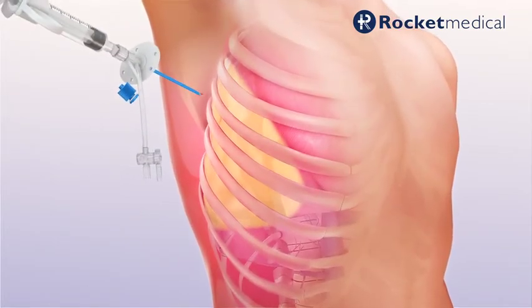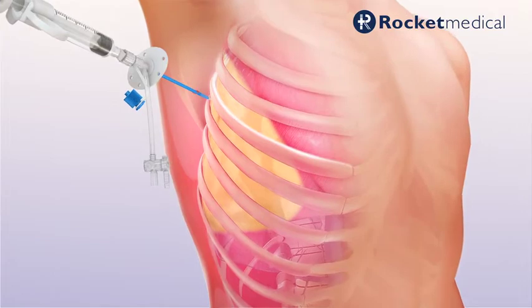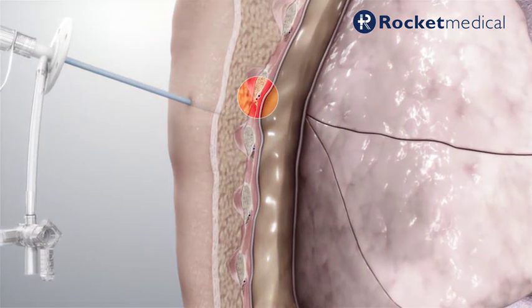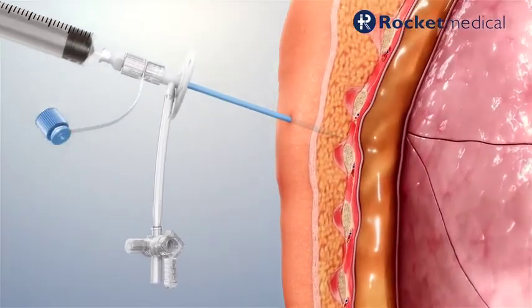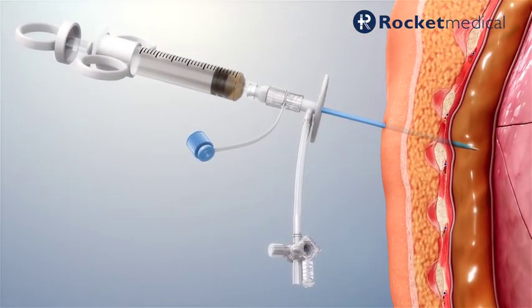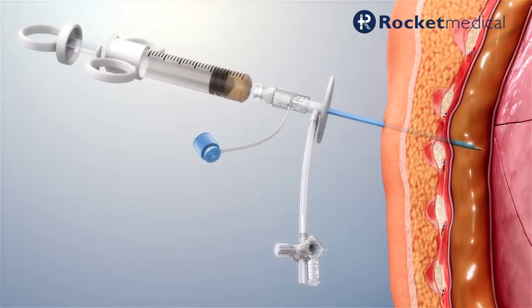Place the catheter through the incision over the superior border of the rib, avoiding the neurovascular bundle. Pass the catheter through the intercostal muscle while drawing back on the syringe. Stop the insertion when fluid is aspirated.